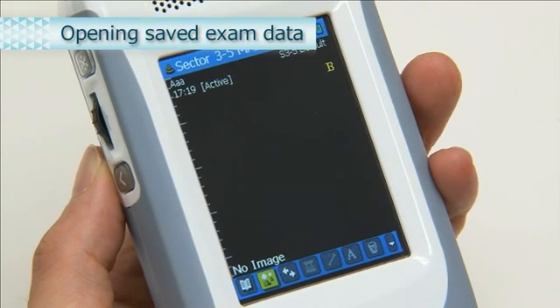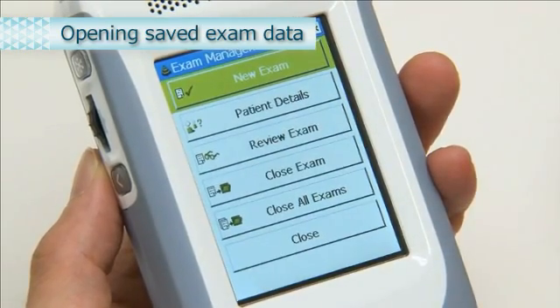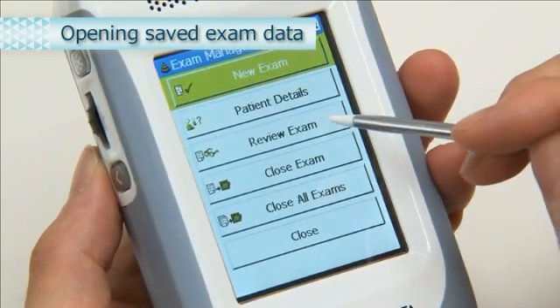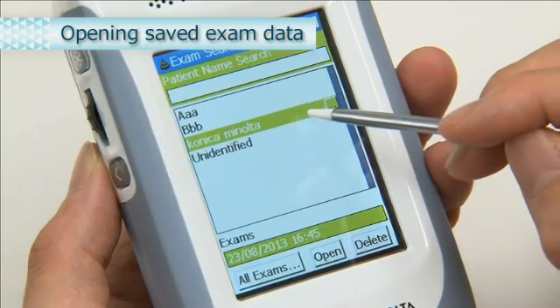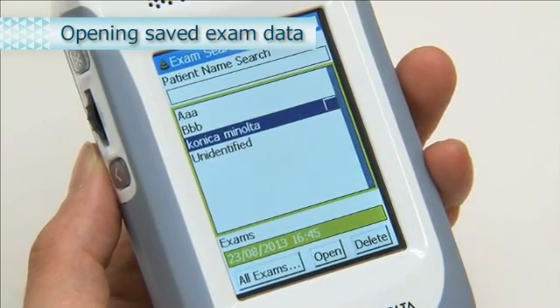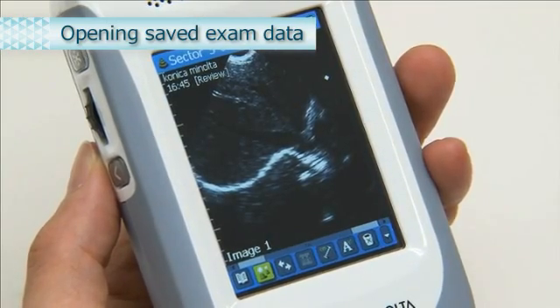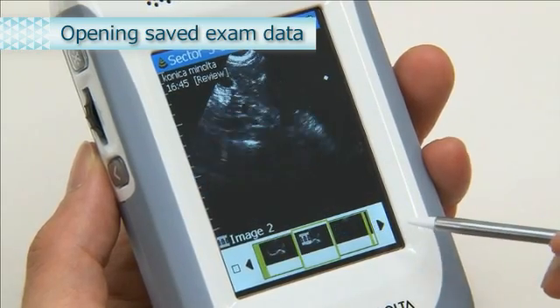We will now explain how to open an exam screen. From the toolbar, select the Exam Management icon. Select Review Exam. From the List screen, select the exam you wish to open and click Open. To view the exam from the toolbar, select the image exam scroller icon. You can now view the saved image.